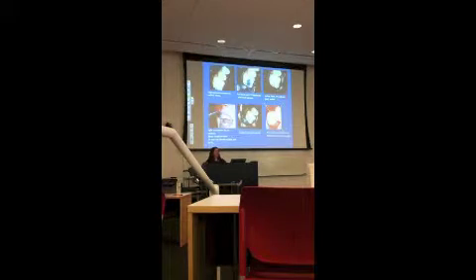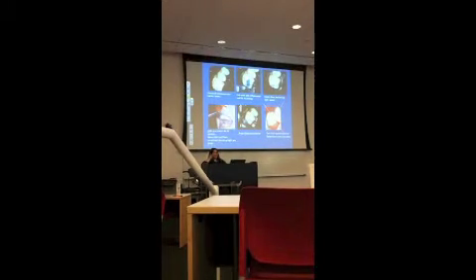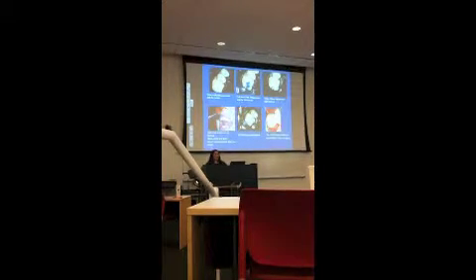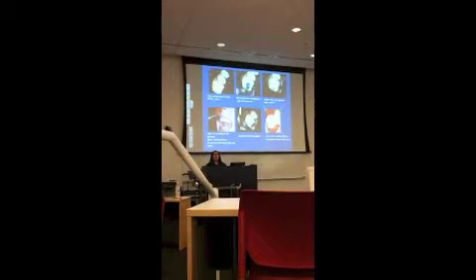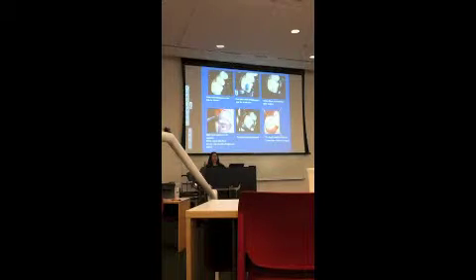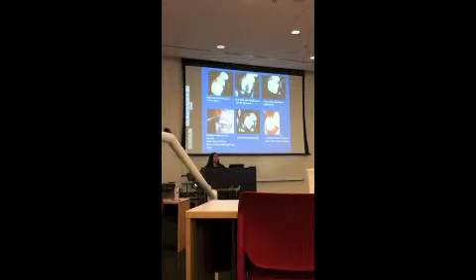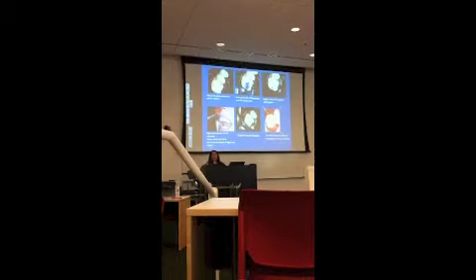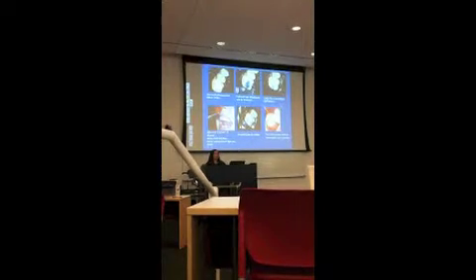Sometimes I add to it a little bit, especially if I'm on the distal of the upper molar all the way in the back. I just like to give it a little extra light. And then you want to go back in and check with the Explorer to make sure that the sealant stays. Like I said before, it's sometimes difficult to keep those distal pits of the terminal molars dry. So sometimes you can actually see some sealant that's come off. If that happens, you just want to go ahead and suction all the moisture out, dry it really well again, and try to reapply it. Just put a little drop of the sealant back in there.